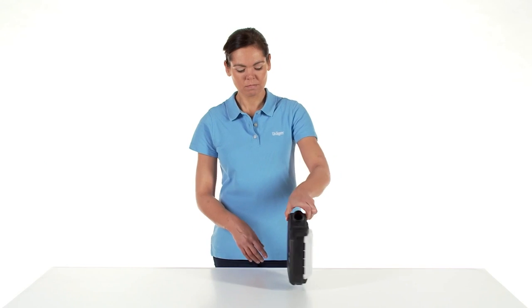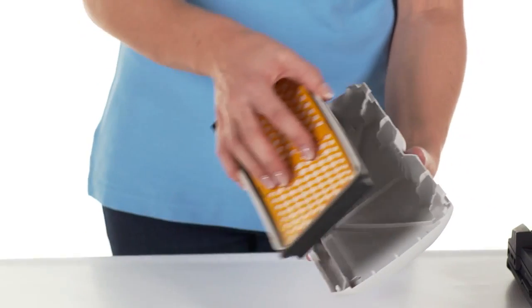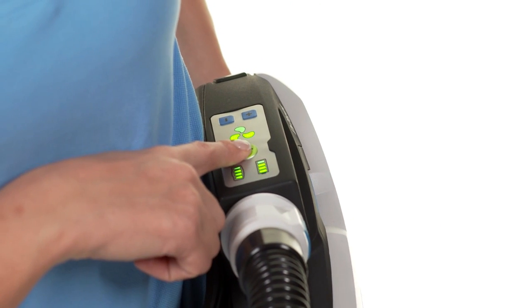Below, we show you how to prepare the DREGA Explore 8000 unit for use, how to replace a filter, attach the various facepieces, and what you need to consider after use.